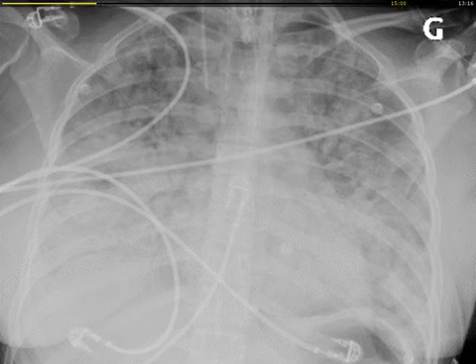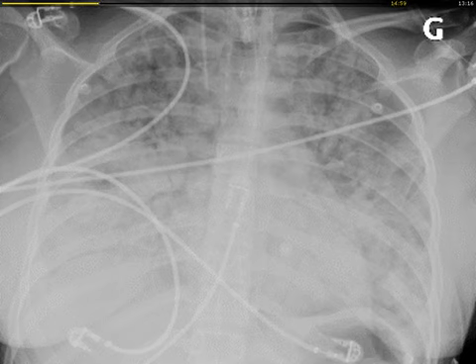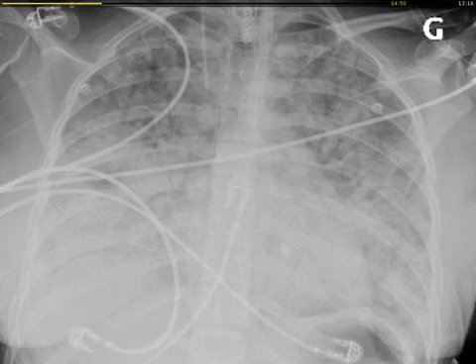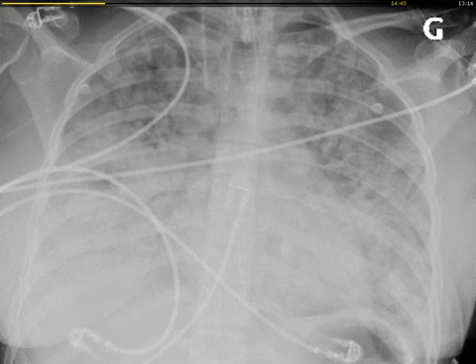So it will deliver a combination of tidal volume and respiratory rate with a low tidal volume, 5.5 ml per kilogram of predicted body weight, and a high respiratory rate. If we look at the oxygenation controller, it looks at the SpO2 of the patient and compares it to the target, and actually you see that the SpO2 is higher than the target, so FiO2 is decreasing.